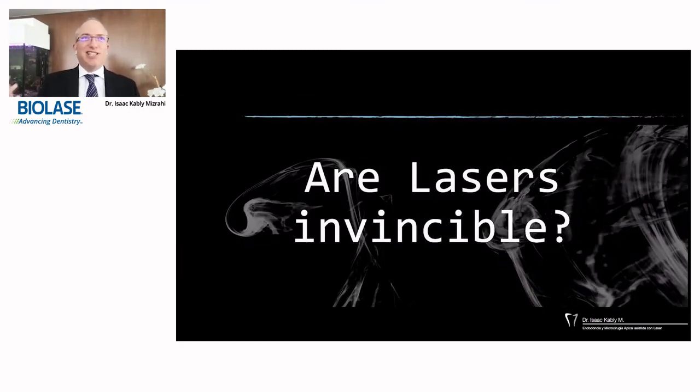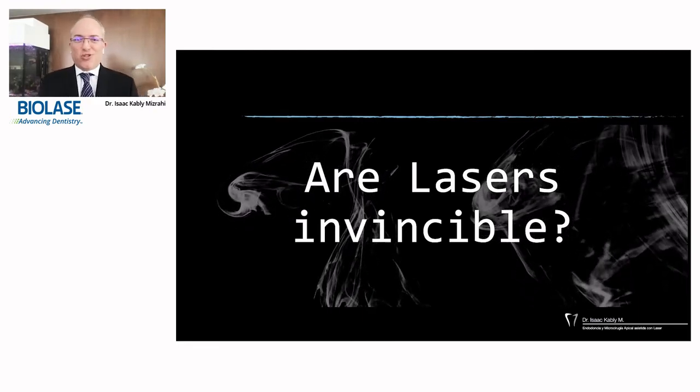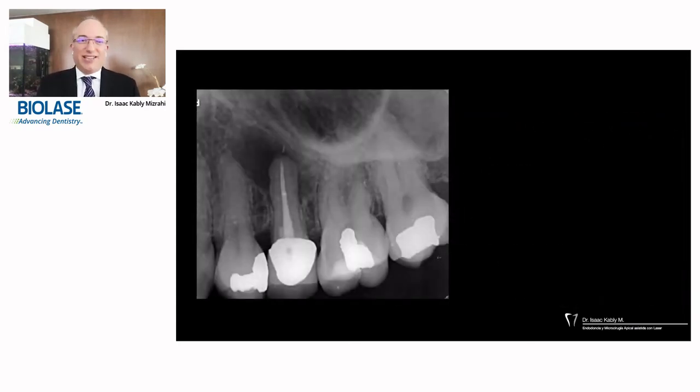So what is this guy saying? That lasers are invincible? That I should use lasers and that's it? Oh no, lasers are not invincible. This is a treatment where I used the same protocol as stated before. This patient came with a huge amount of pain. I did the treatment. This, by the way, is not the initial X-ray. This is the final X-ray of my endo treatment. And with this lesion, it stopped the drainage.